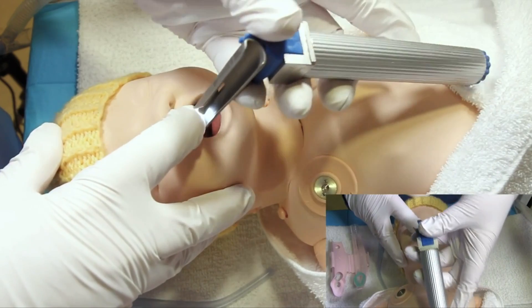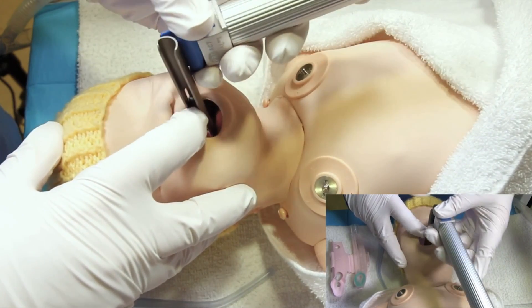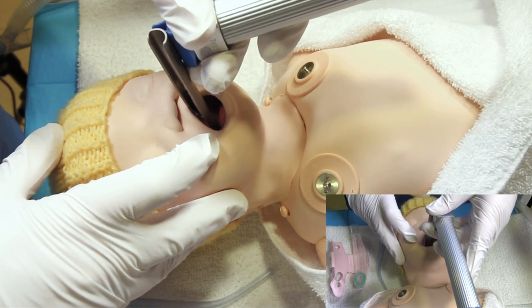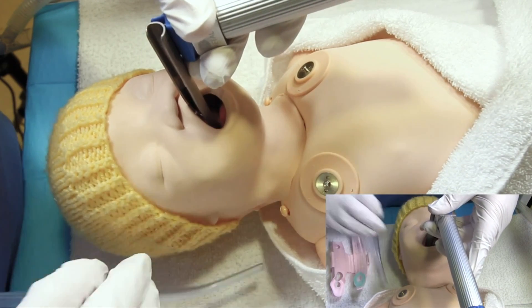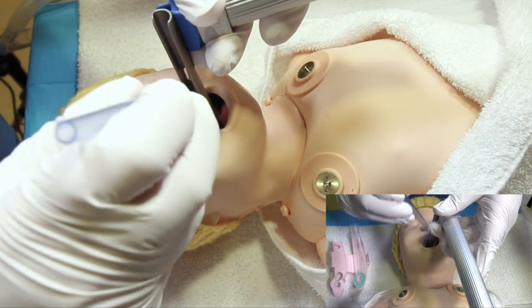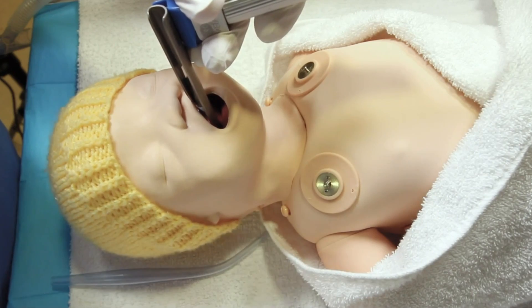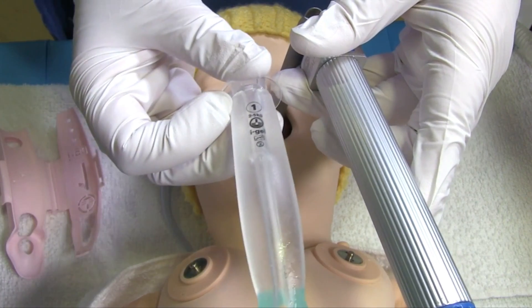You can insert the laryngoscope into the baby's mouth, holding down the tongue and holding it over to the side. You can look into the back of the oropharynx and if there's any foreign material there, such as meconium, then you can remove that.